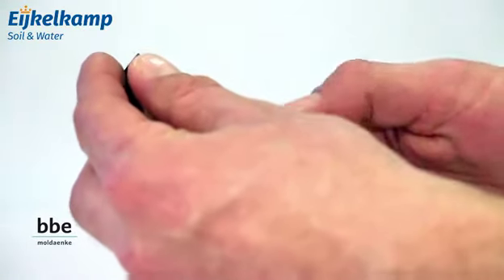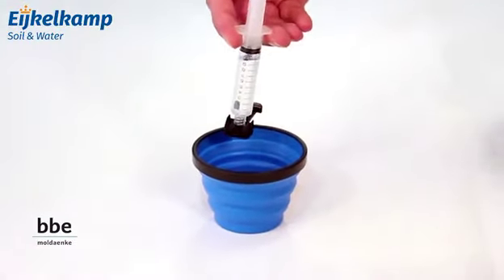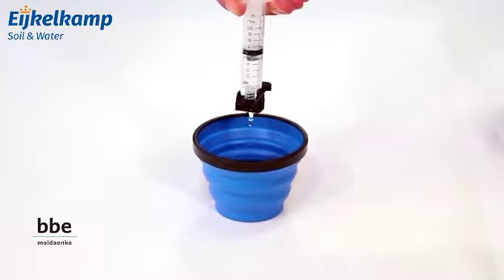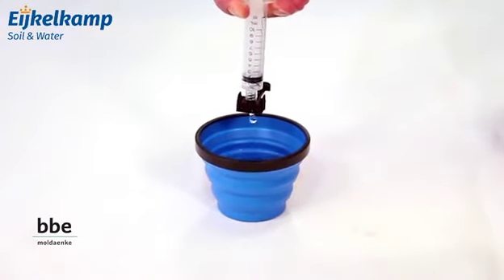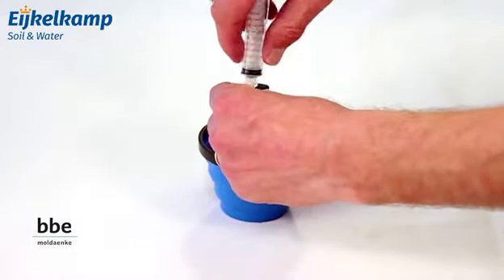Screw the syringe onto the filter unit and filter the water sample slowly by dripping. After filtration, take the filter strip out of the filter unit.